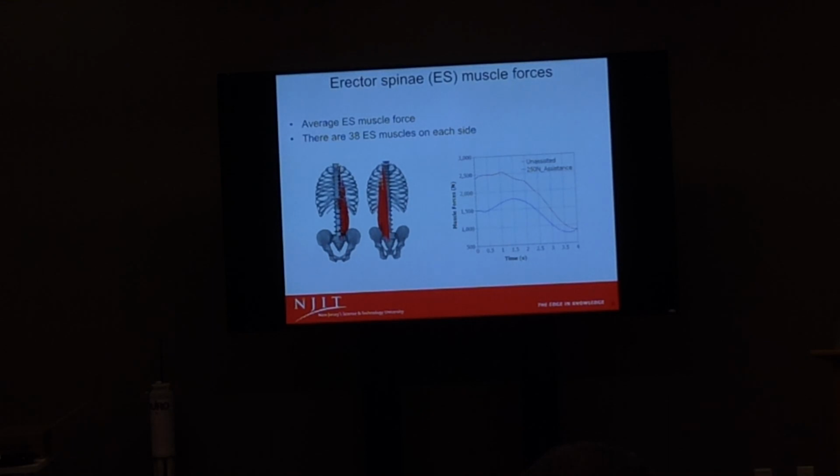So that's going to be from the model. We're trying to see how this robotic device impacts human motion, and maybe in the future we can design a better actuation profile such that you can reduce the muscle force even more.